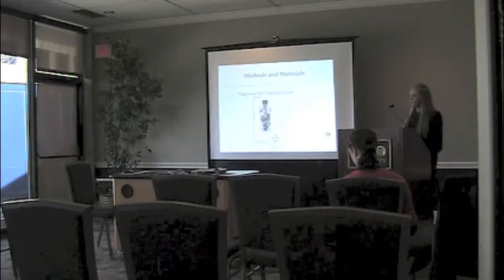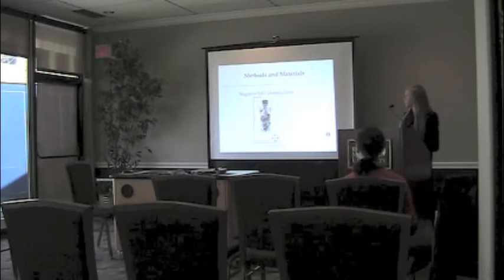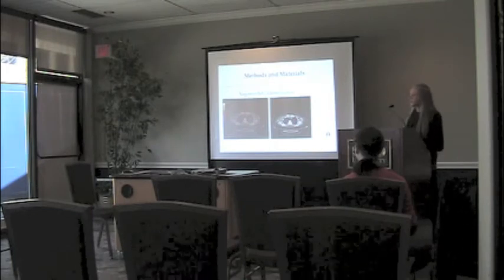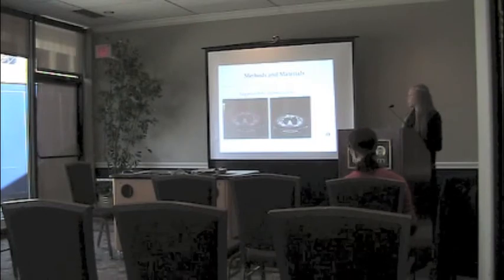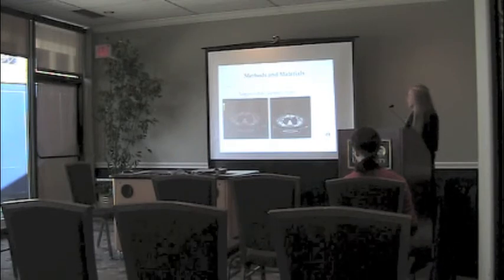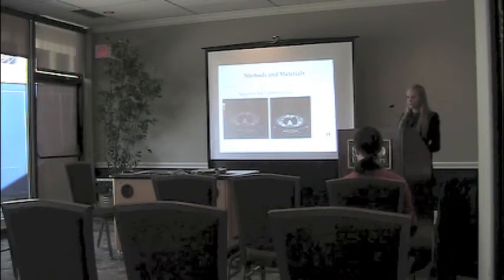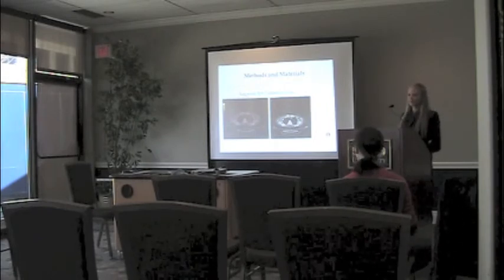So it's just brown adipose tissue that we're seeing, not possible cancer or anything. Here's an example of a negative BAT identification. There could be symmetrical bilateral uptake here, so you want to look further from the MIP image into the PET-CT images. Again, on your left is the PET-CT fused. The brighter the color, the higher the metabolizing cells. You see increased uptake. You're going to look again at your CT image and see if there's any correlating anatomy with that. If I had a pointer, I'd show you, but there's a possible abnormal anatomy there, so it would possibly be tumors. So this would be negative for BAT and positive for possible cancer.